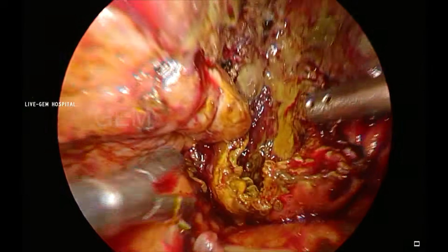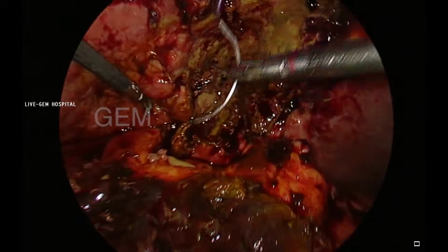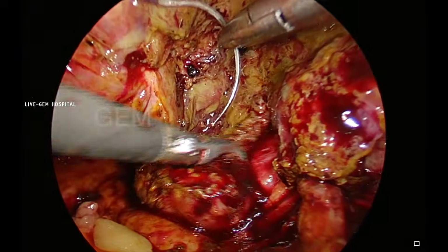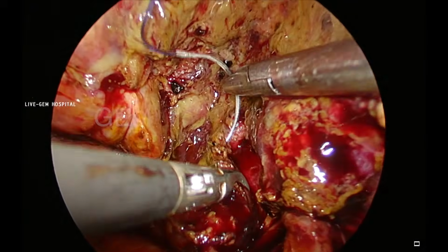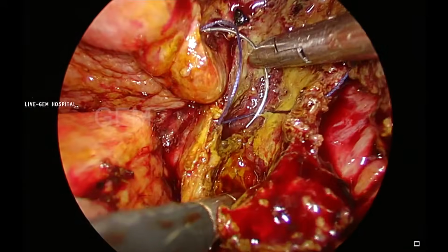So that is the infundibulocystic junction, and here it looks like the artery and wall together. Maybe I can trim this wall a little bit. So this side it is very close to the CBD. This is the edematous wall, that's why it looks big.